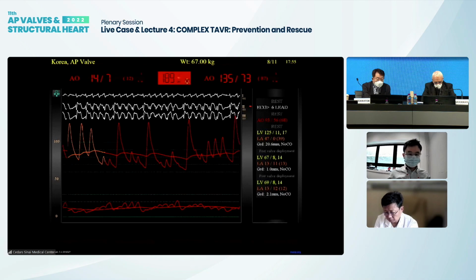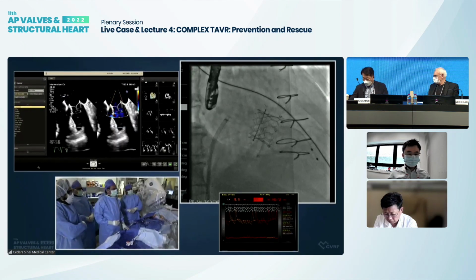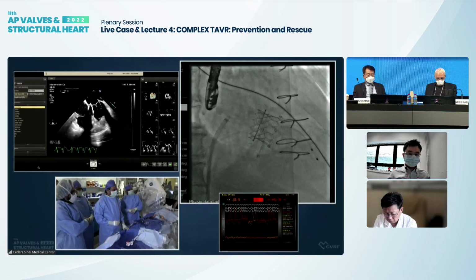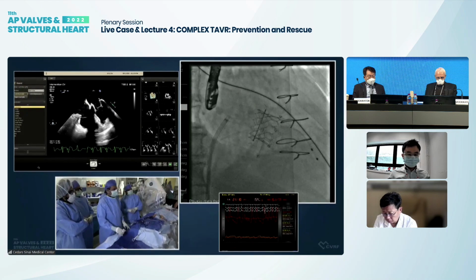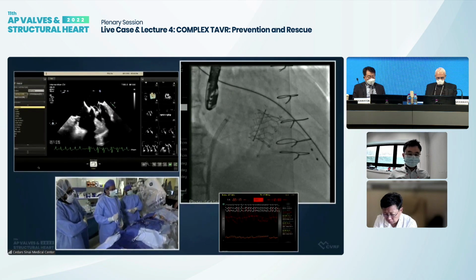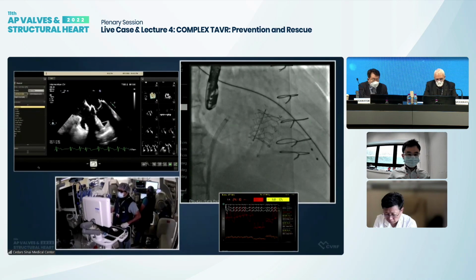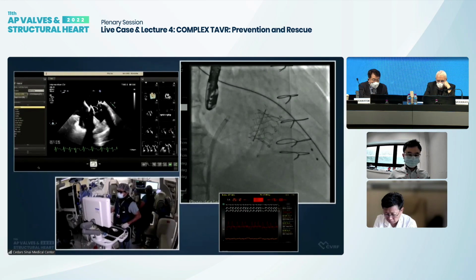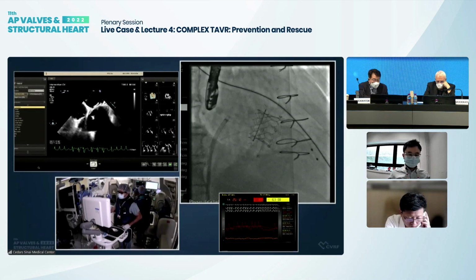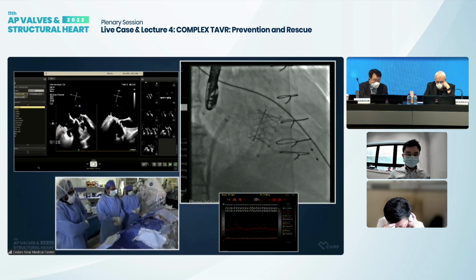Now do you see anything else around the valve, around the heart, just to be sure? The valve is good? One thing that has changed, and we've slowly learned this over the years, is that when we take away mitral regurgitation in these patients with failing bioprosthetic valves, the LV shrinks. And in many of these patients, the right ventricle can be scarred for whatever reason, they've had a bypass run and so on. So if they get very tachycardic, we can see transient RV dysfunction. At times air can also get into the coronary. But something we just have to be cautious about is RV dysfunction after deploying these TMVRs in prior valves. Okay, so at least there's not anything functional, right? Yep. So we are supporting the right ventricle right now, pharmacologically.